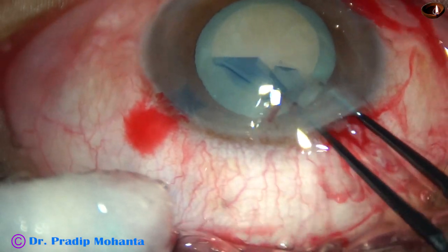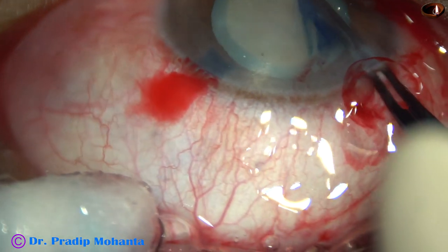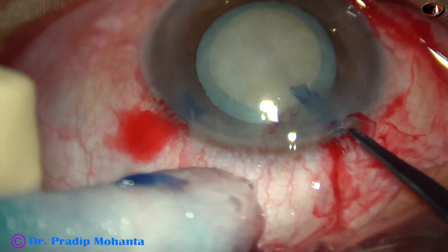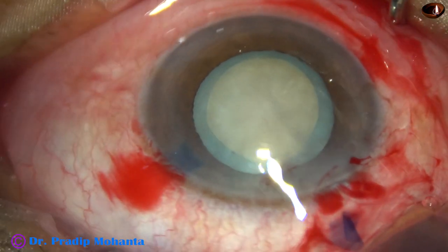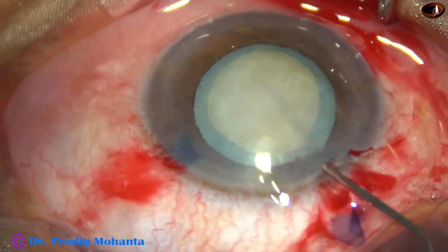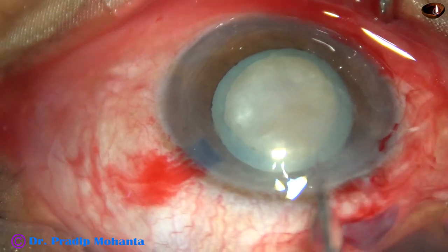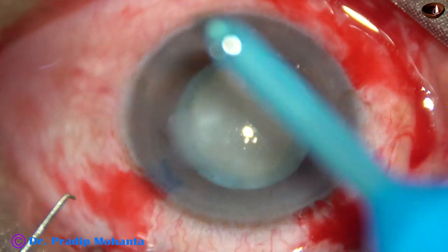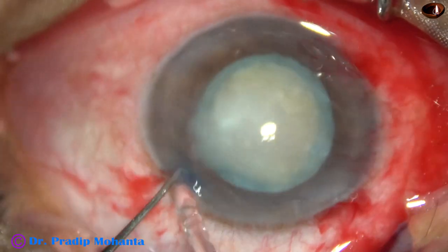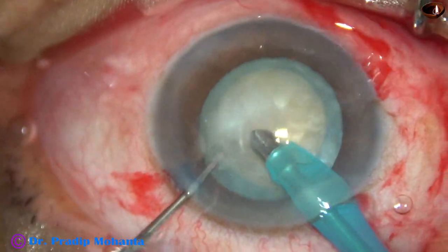And in this case, I decided to do rhexis on-the-go, and it was done easily. But we should aim for a 5 mm rhexis in this case. If the rhexis tends to turn to the periphery and run away underneath the iris, we should have some threshold to bring it back.